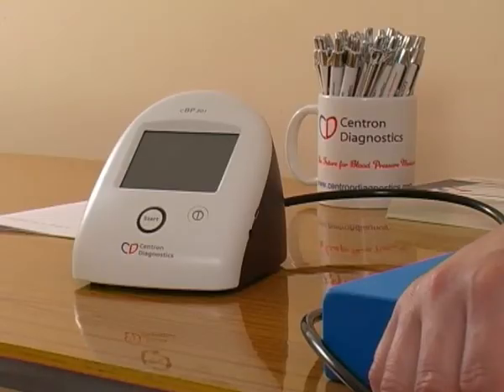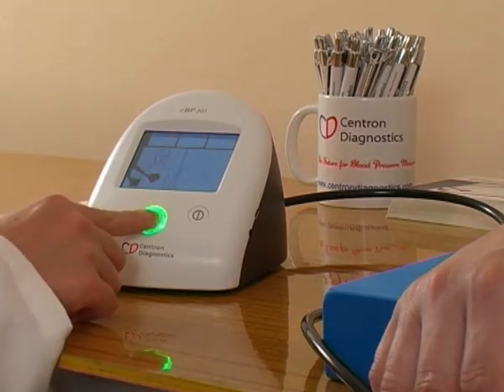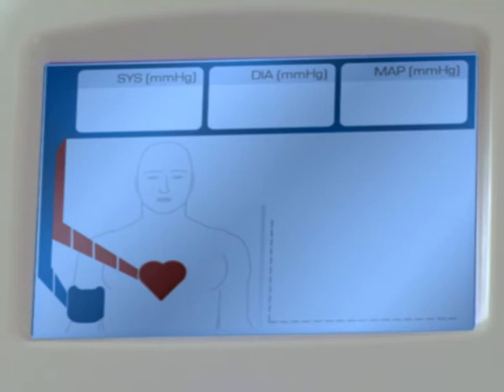Turn the unit on by pressing the on button. Press the start button to initiate a measurement. A standard peripheral blood pressure measurement is then taken and the results displayed in the blue boxes.